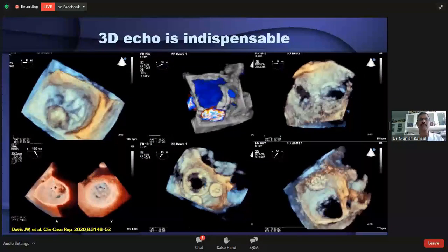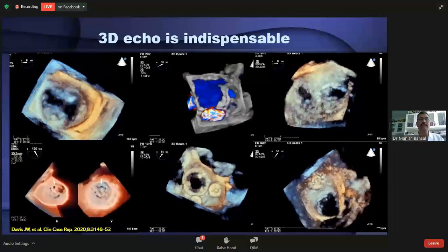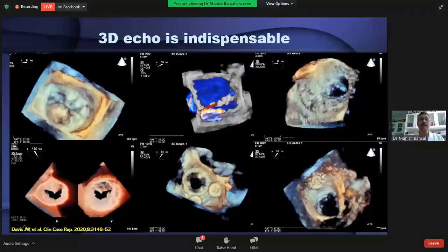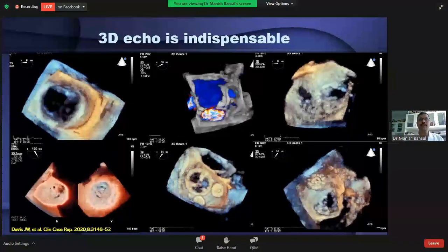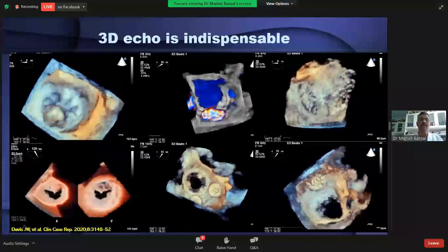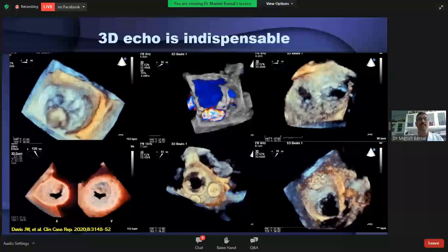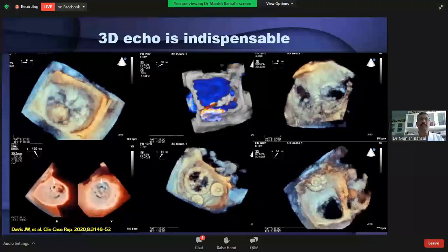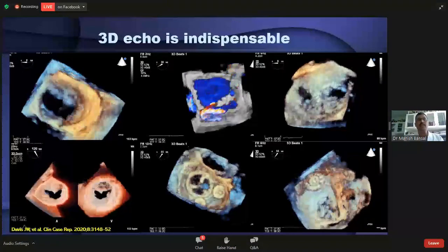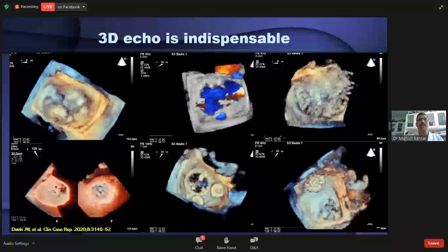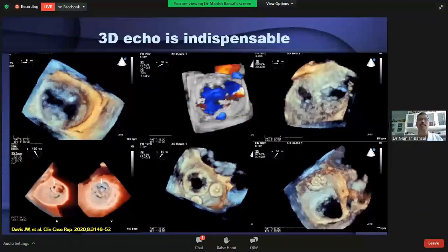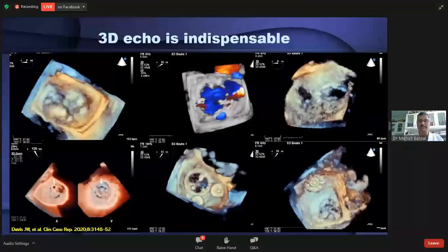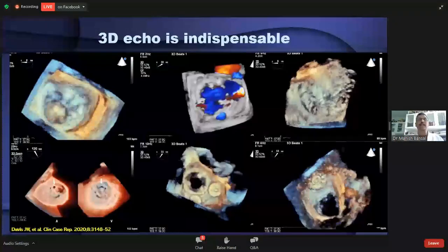The main role of echo during the actual procedure is to provide spatial orientation and to guide the path of various devices, catheters, and implants. 3D becomes very useful because no other modality gives such good spatial orientation and display of cardiac anatomy as 3D echocardiography. 3D TEE plays a very important role especially for mitral valve lesions, and it is also easier for interventionists to interpret compared to 2D images. However, 2D TEE remains the main modality even during the procedure.